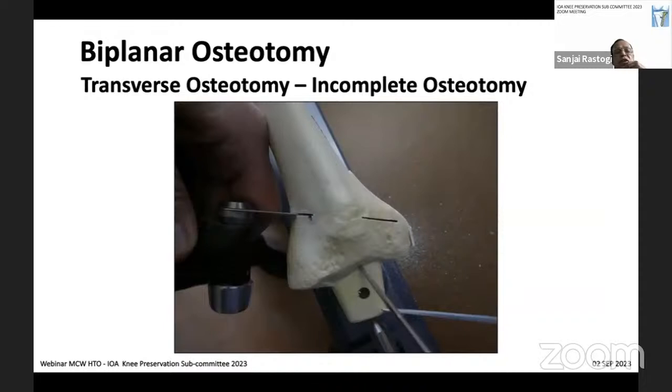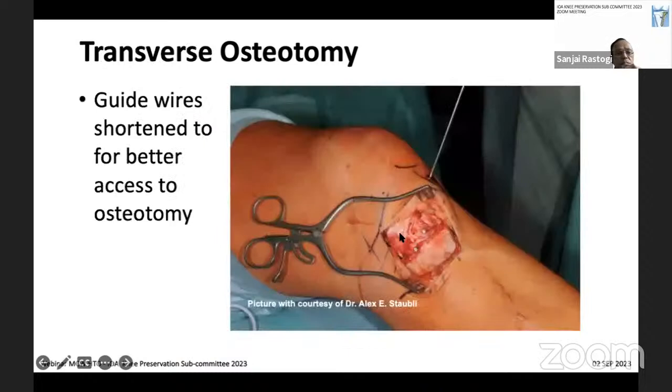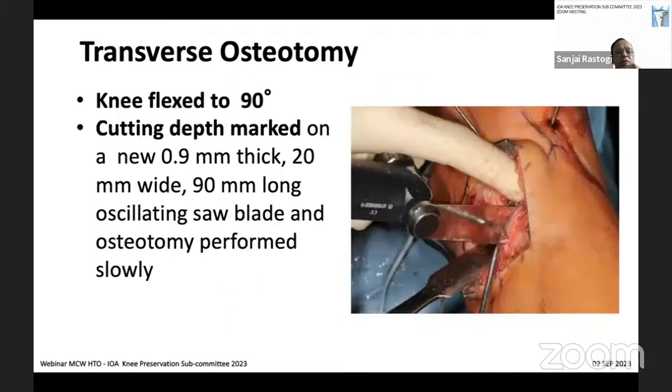This is the concept of transverse osteotomy, which is an incomplete osteotomy. As you can see, in the posterior part, the posterior area is not cut. The protruding wires are cut to have easy access for osteotomy. Transverse osteotomy should always be done with about 90 degree flexion.